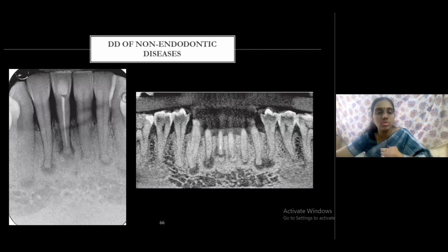It's a case of cemento-osseous dysplasia where it was misdiagnosed as periapical lesions, and the CBCT sections made the differential diagnosis very clear.